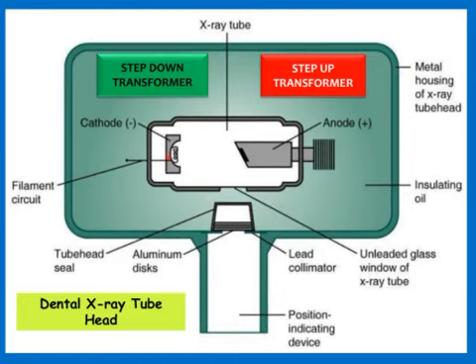Now the other area where tungsten is used is the target. We want the electrons to move from the filament area, that is point A, to the anode area, in the region of the target, that is point B. That means the aim of the electrons is towards B, so B is the target of the electrons. Targeting means to aim. So electrons go and hit the tungsten target once they are produced, so its name is tungsten target.